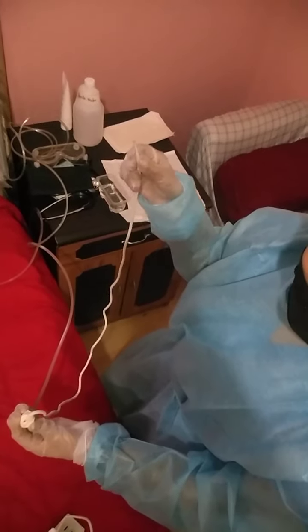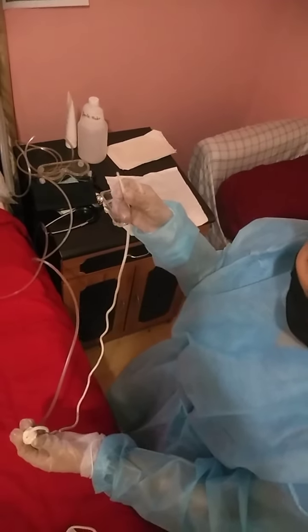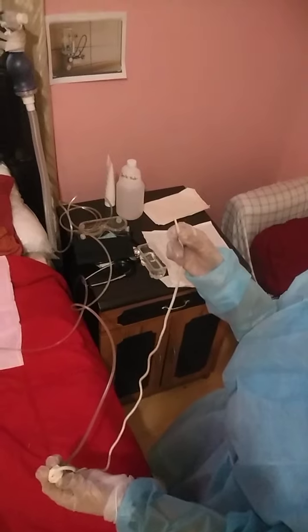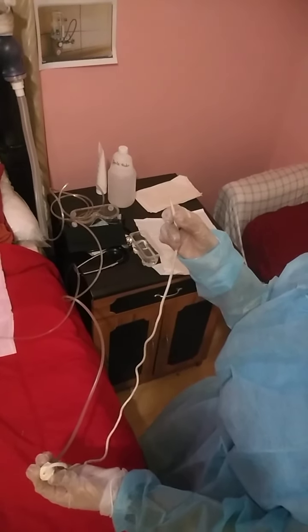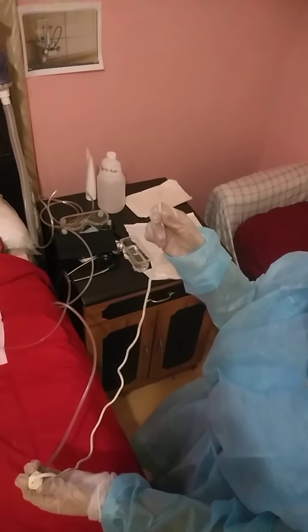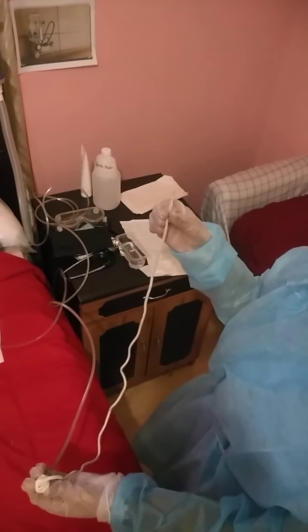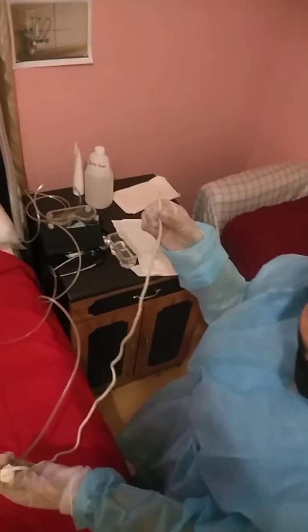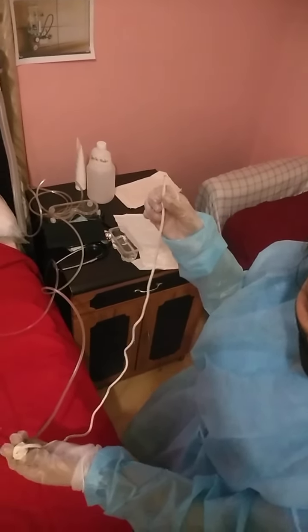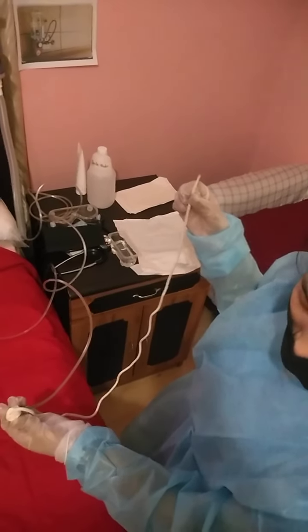Attach the catheter to the connecting tubing to make sure the equipment works properly. Suction a small amount of normal saline from the basin. Increase the patient's prescribed oxygen flow and instruct her to breathe slowly and deeply. Lubricate 6 to 8 centimeters, or 2.4 inches to 3.2 inches, of the distal end of the catheter with the water lubricant gel.